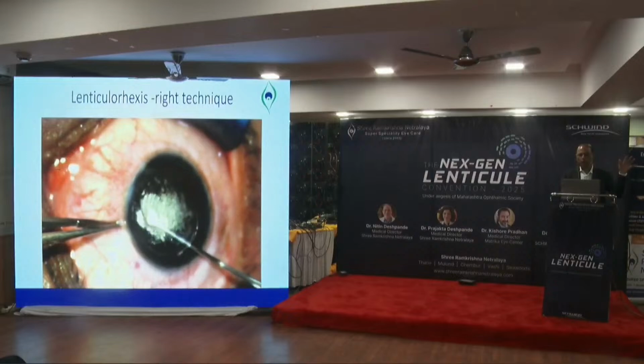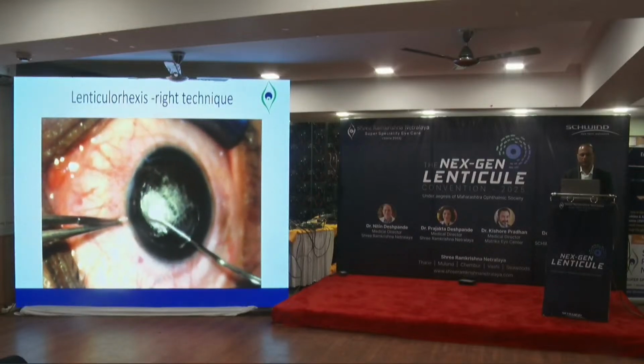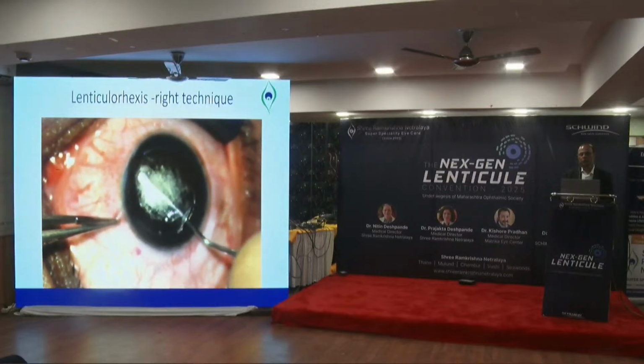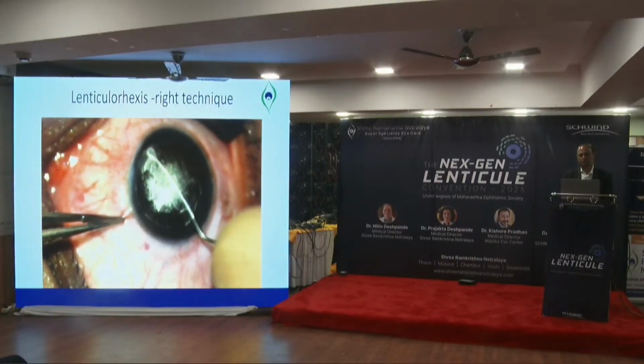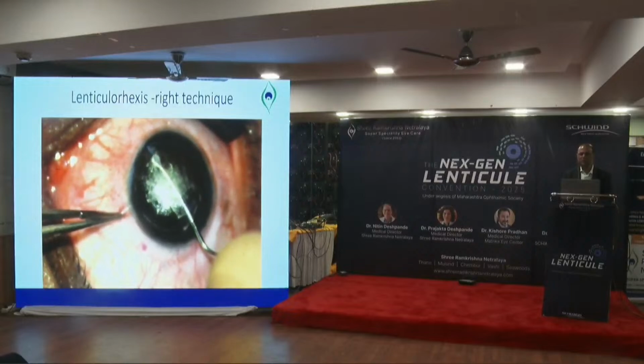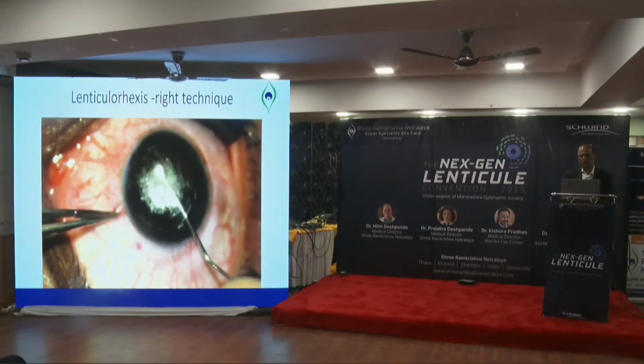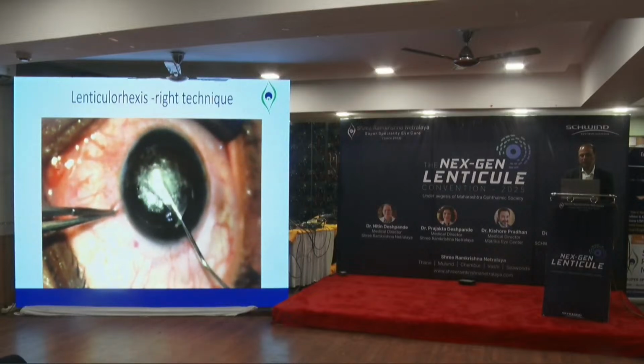So every time you have to leave some tissue on the left side, otherwise you are going to fold the whole lenticle. You go to the other side now. So these are our very initial first, second session videos. We are able to dissect.